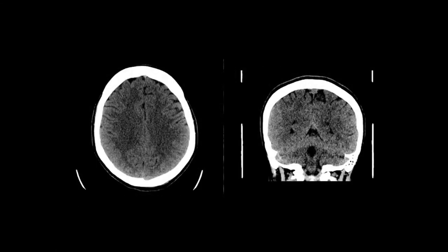Here are two images from the same patient's CT examination. On the left of your screen you have an axial slice through the level of the mid-vault. This is a coronal slice and you should look at this as if the patient was looking out the screen towards you.